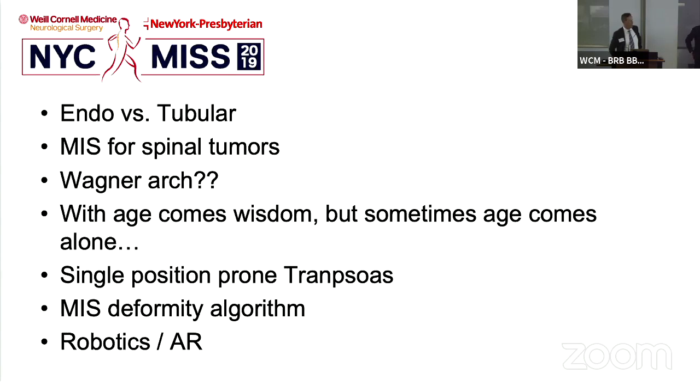But maybe you're right. Yeah, I think you're talking about your focal length. If you change your focal length with the traditional glasses you have to put on to see the 3D overlay on the remote screen, if you move your head around, you lose that 3D feel, right? That's one of the benefits that we're thinking we would get rid of by putting it on our head-mounted display, because your interpupillary distance from the retinal display is never going to change no matter how you move your head. So you're never going to have that loss of 3D. So you combine the exoscope with the.